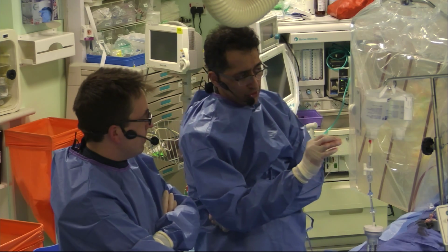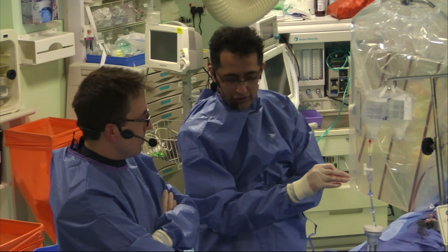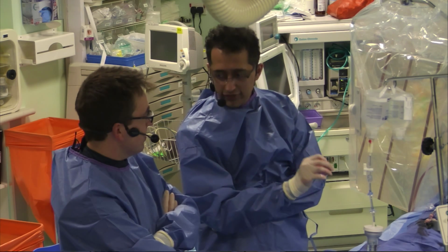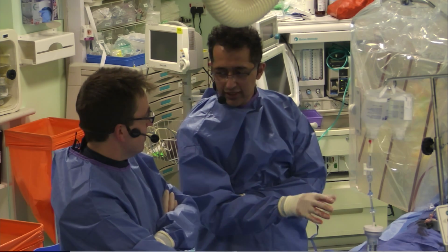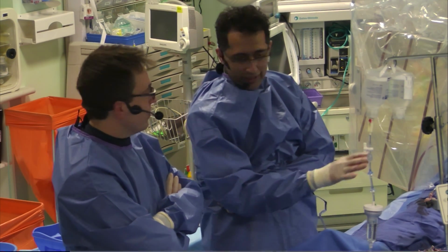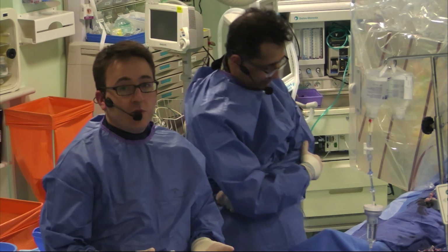There's an unusual anatomical appearance because it's a very short left main stem. And I think it costs us nothing to actually just IVUS the ostium and answer the question that the clinician who referred for this case actually also asked us to do. So, physiologically, this is not a vessel that I'm particularly keen on treating. I'll give the anatomical information about the ostium, but I'm not planning on treating that either because physiologically it's not significant. But we'll have a nice picture to have a look at. So I'll let you get on with that and do the IVUS.